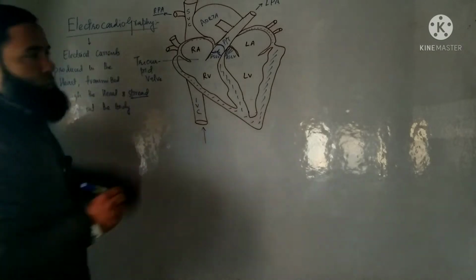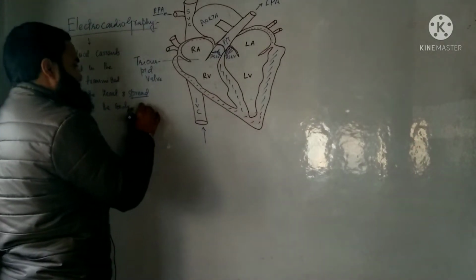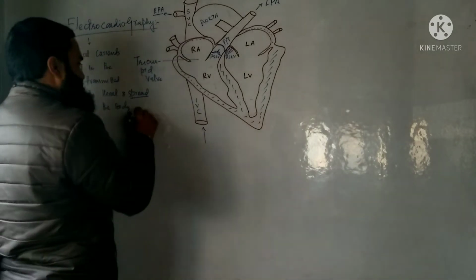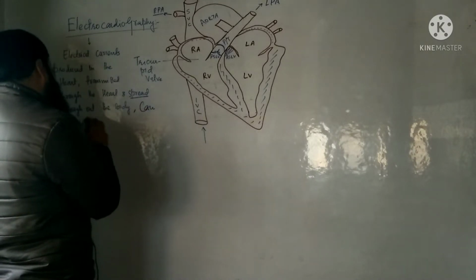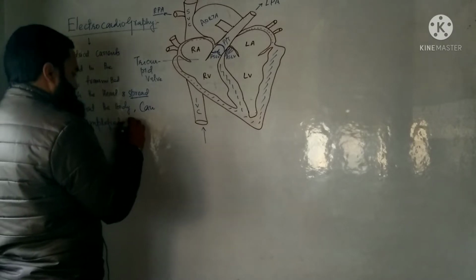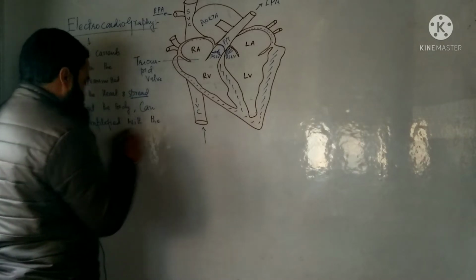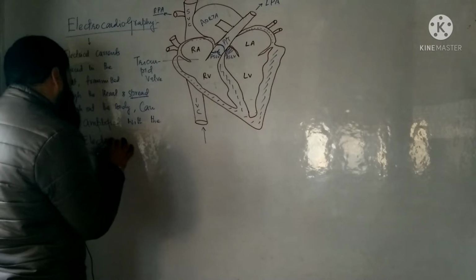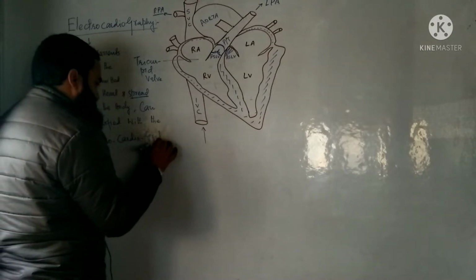This is called electrocardiography, and this electrical current produced by the heart can be amplified with the electrocardiograph.